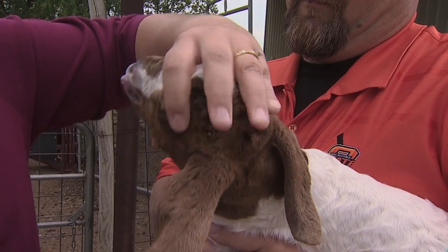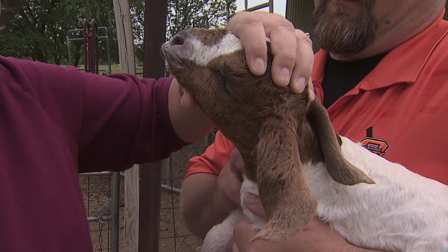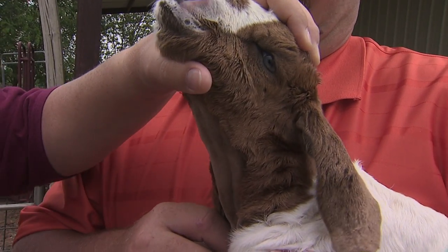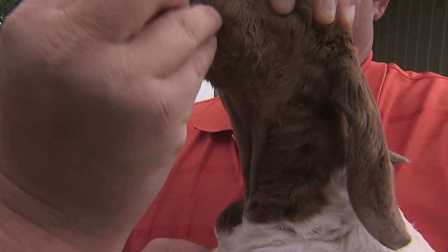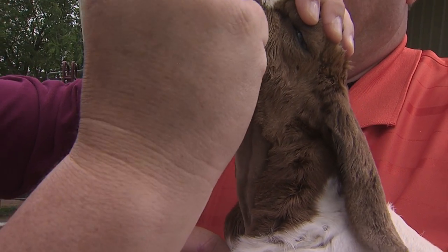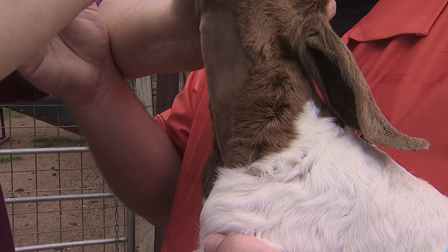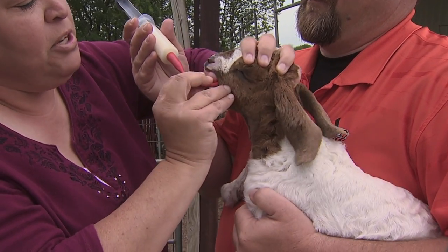If you put the tube in the left side of their throat it should go down into their esophagus. If you put it down the right side of their throat it has a really good chance of going into the trachea. So we're going to look for it right here in this little crease. If you can't see it, you've got it in the trachea. You can use your thumb as a block to keep her from biting it. Right there — you can see it moving in her esophagus. Once you see that, you can continue pushing it down, and I like to push it down all the way.